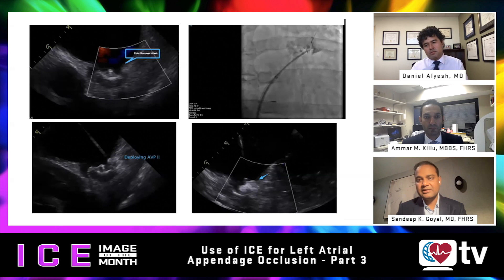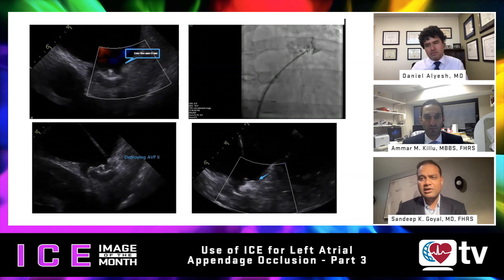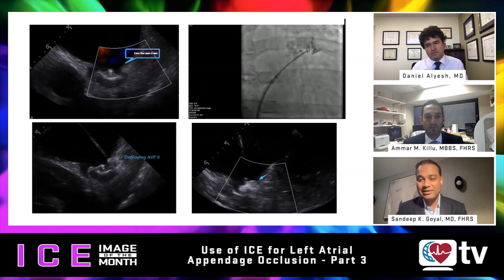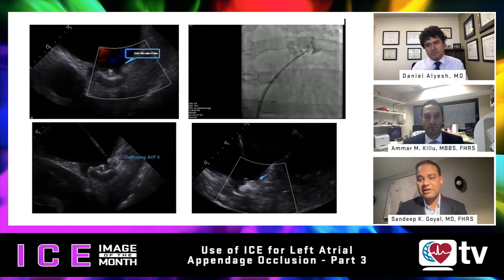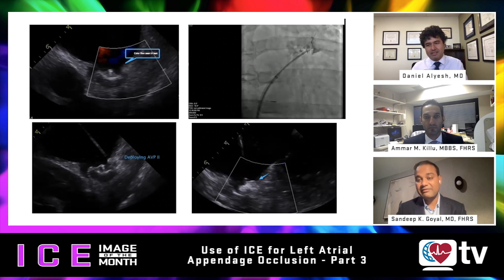These are very complementary technologies. Whether you are using TEE or ICE, fluoroscopy is clearly very helpful, especially for the Watchman device going into the distal appendage. If you don't do pre-CT, you may not realize what you're getting into with the distal part, even with TEE imaging. Fluoroscopy with contrast can help delineate targets. And especially with proximal pectinates, TEE or ICE imaging could fool you that you have a good seal, but injecting contrast will reveal a leak — as seen in the follow-up at 45 to 90 days.